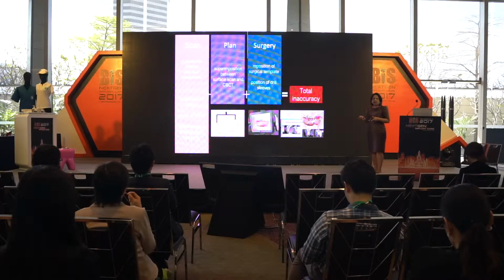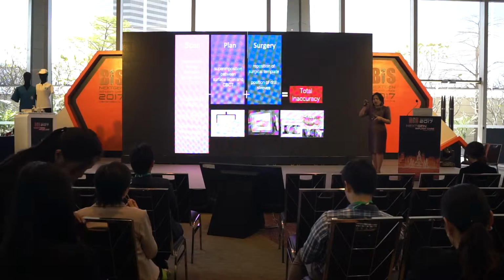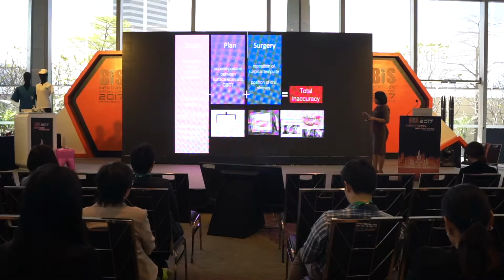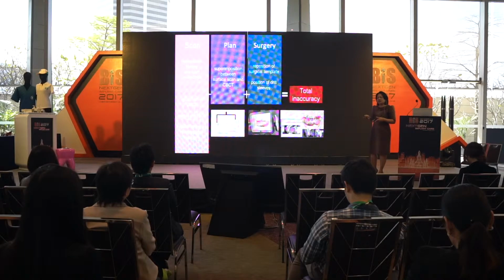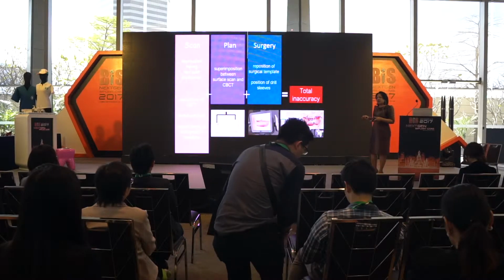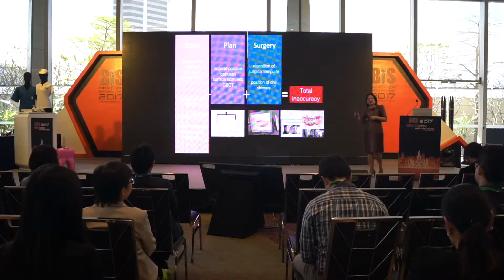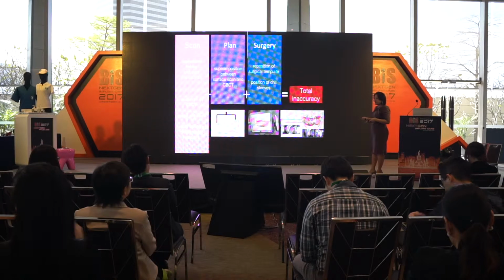In the surgery, we will know where the surgical template is, whether it always fits in the oral mouth, and also the position of the drill. We should check and measure everything here. It's very minimal to make an error, because any error can affect the total accuracy.